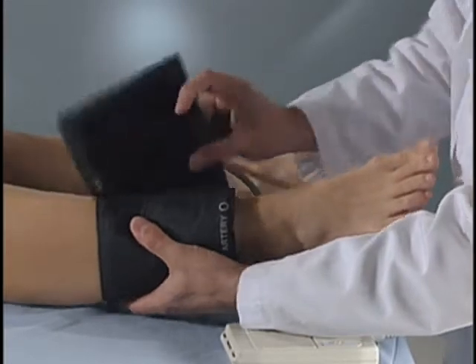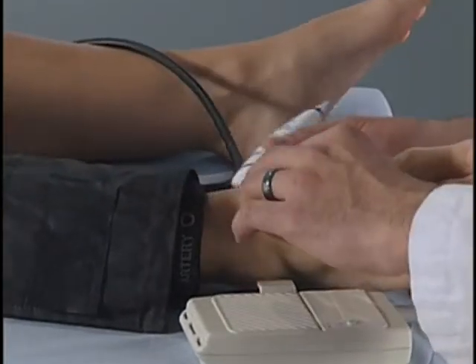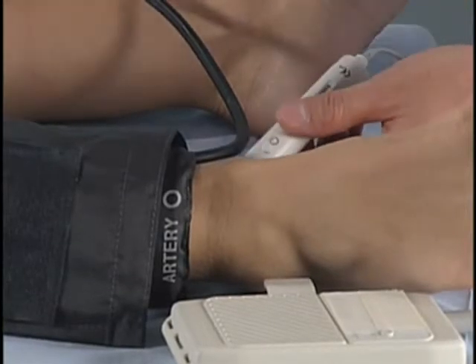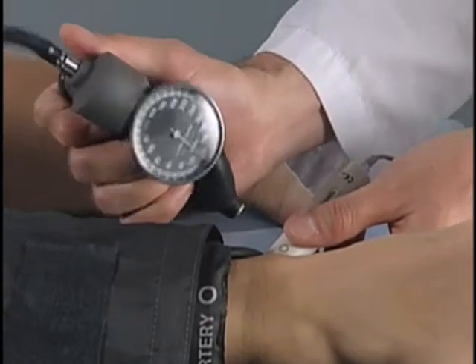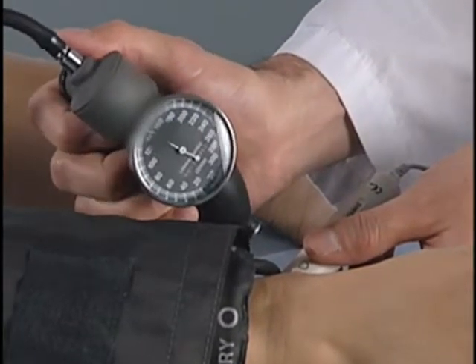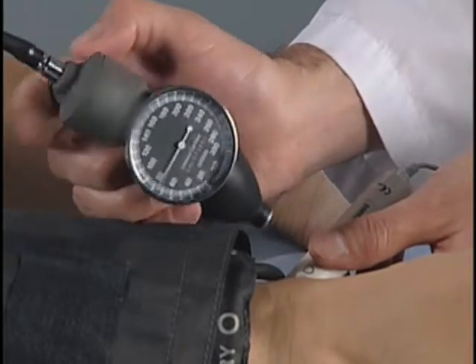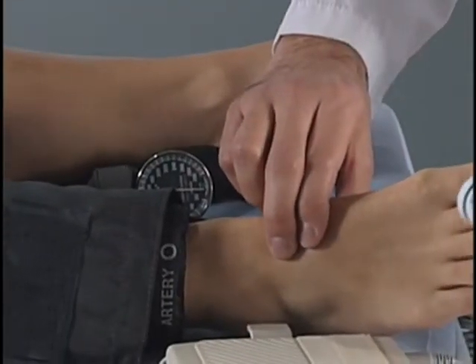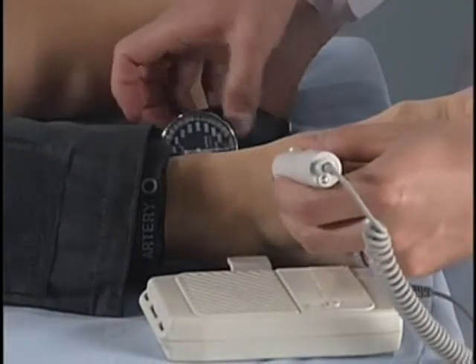Because of its critical impact on health, accurate diagnosis of peripheral arterial disease is important. Careful history taking and physical examination are always required. However, because examiners may differ in their ability to palpate pulses, and because up to 10% of the general population may have congenital absence of the dorsalis pedis pulse, a more objective method to evaluate the peripheral circulation is needed when peripheral arterial disease is suspected. Measurement of the ankle brachial index is a simple, accurate, and generally reliable method for the diagnosis and evaluation of peripheral arterial disease.